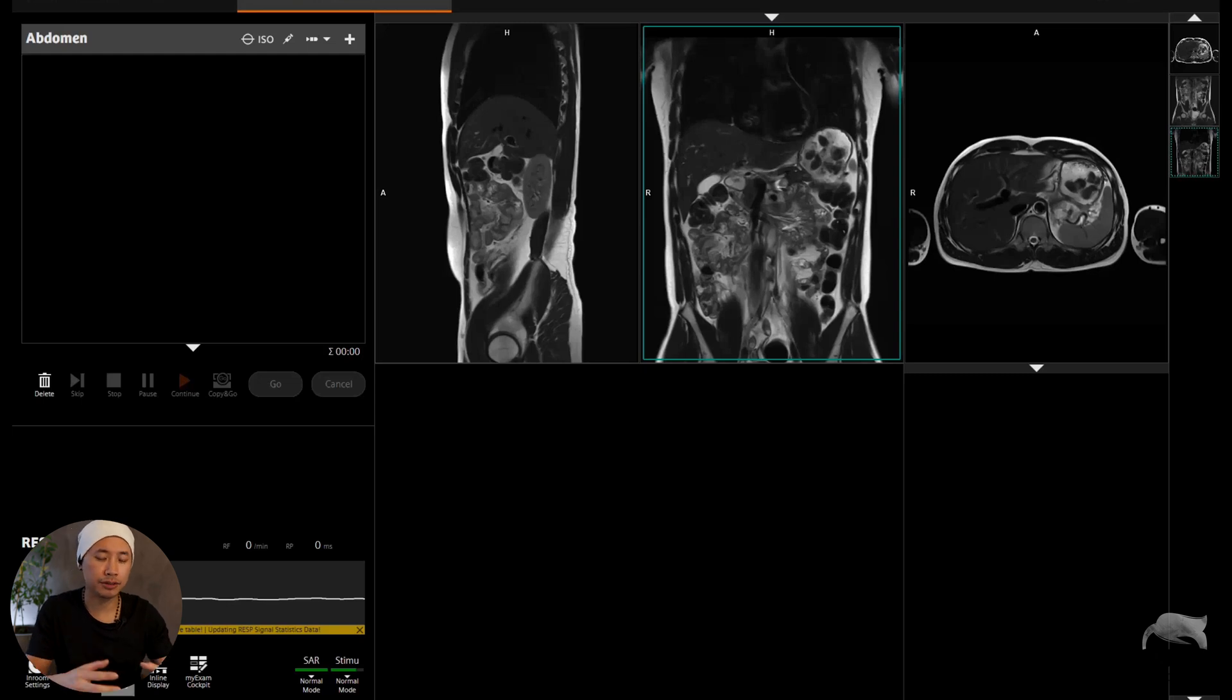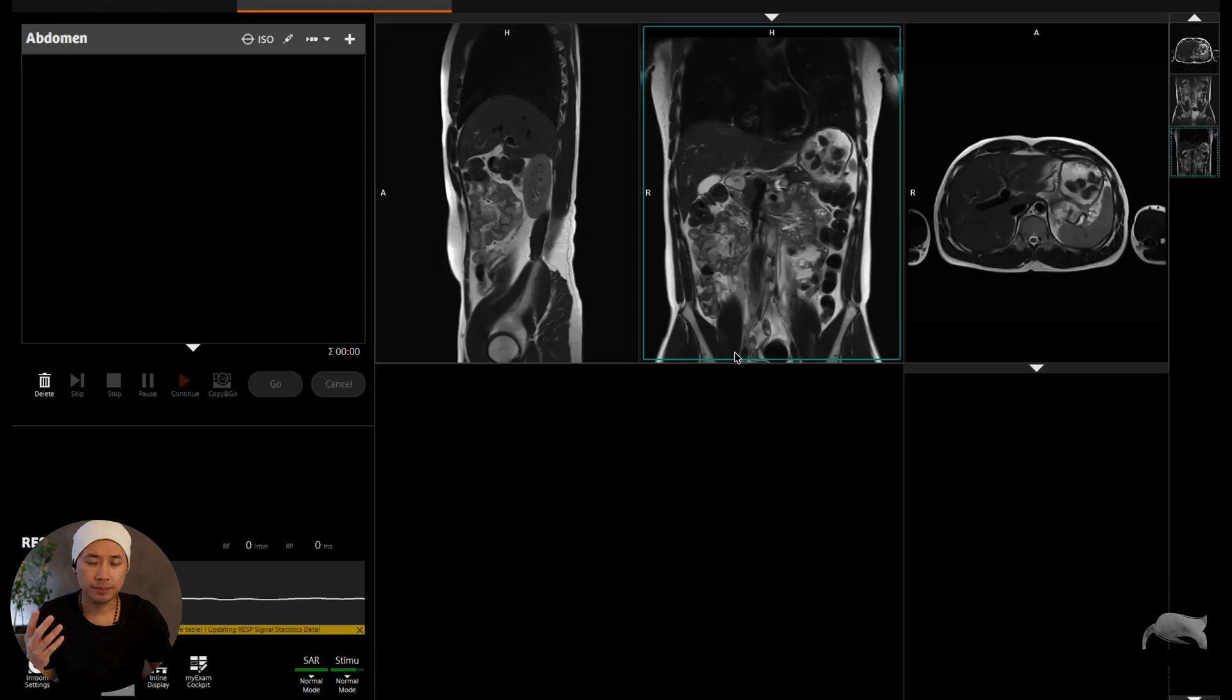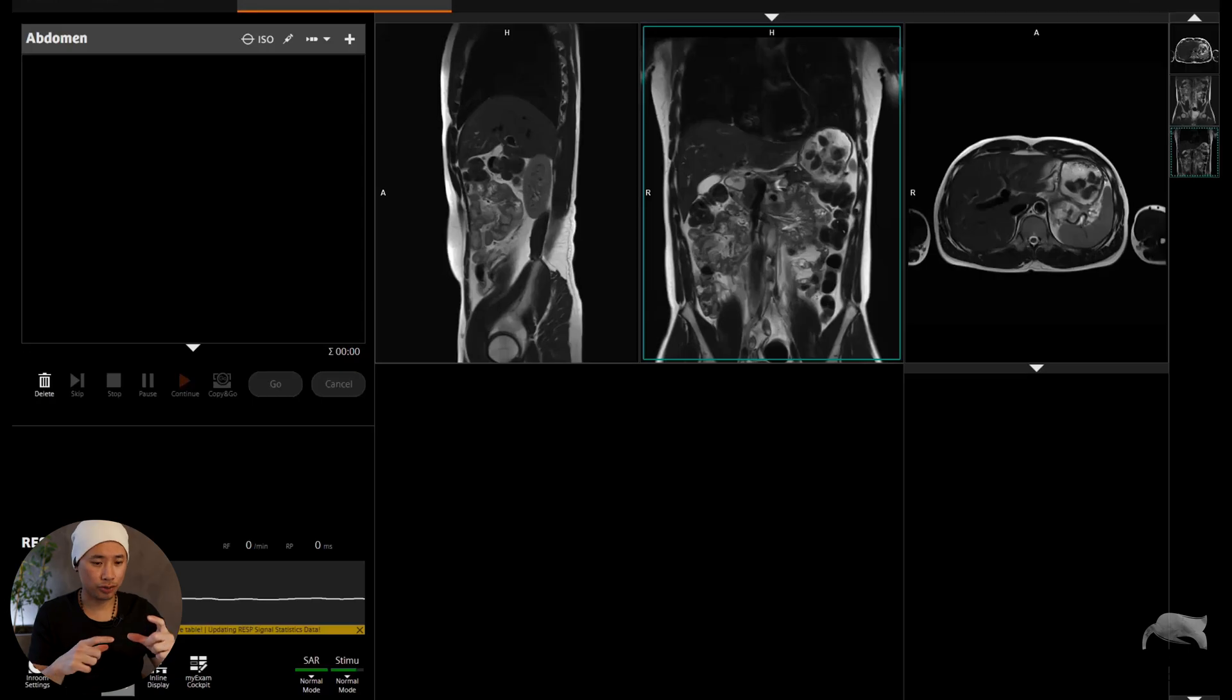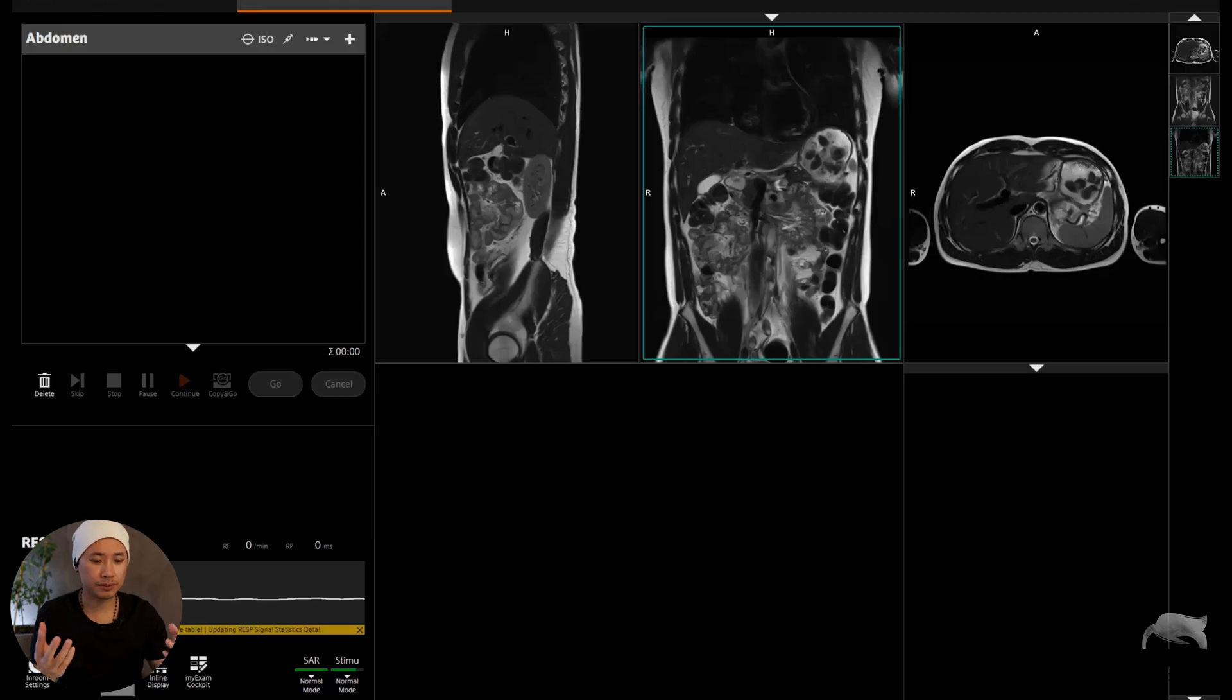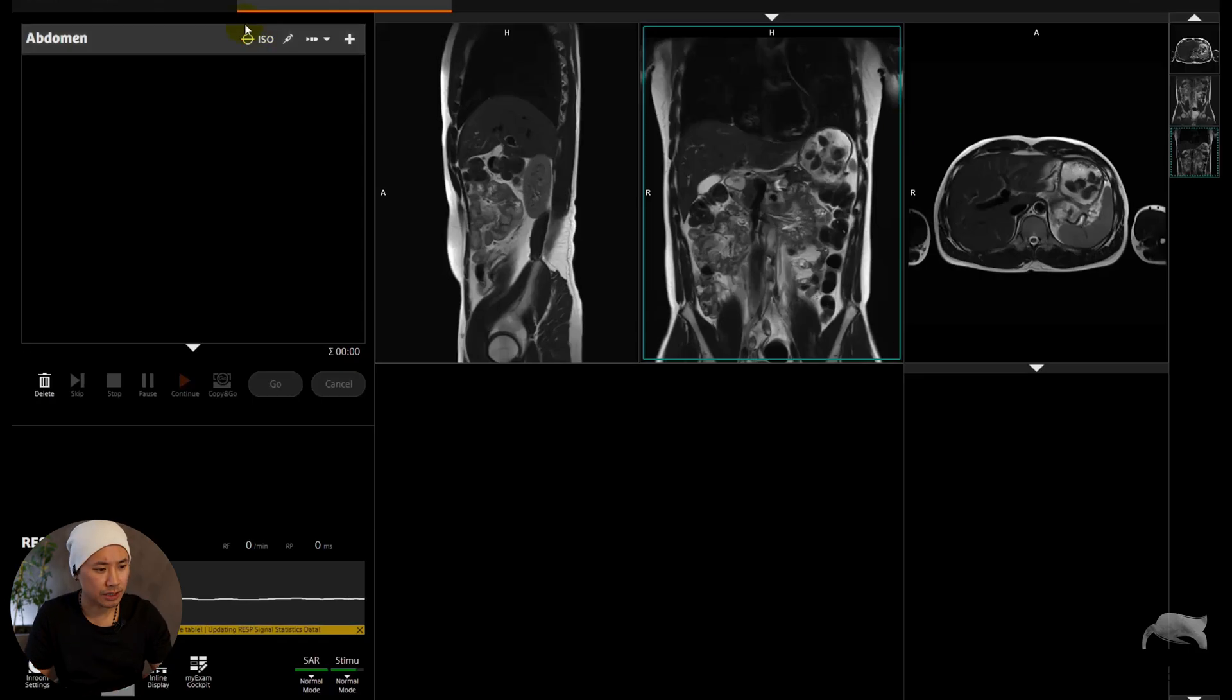There are two localizers, upper part and lower part, and then it's just composed together. Let's say you're gonna have the top of the liver all the way down to the pelvic area. So of course you will need these two boxes here, right? Two boxes of breath-hold, a T1 VIBE Dixon and a HASTE, or whatever.